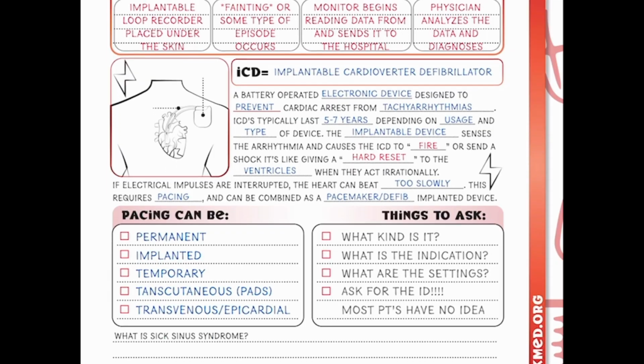And quickly, I wanted to squeeze in this last little rhythm because we didn't talk about it in our previous understanding EKG rhythms lesson, but this is a great spot because this absolutely requires a pacemaker without a doubt. I also have a very dear friend that recently got diagnosed with this, so it's crazy critical to spot if you happen to see it because it can be fatal.